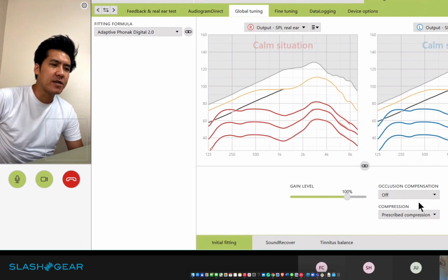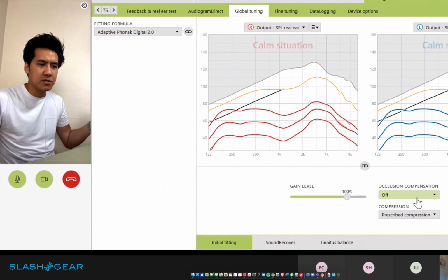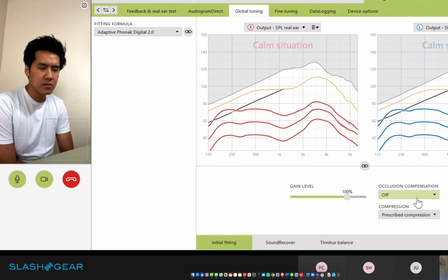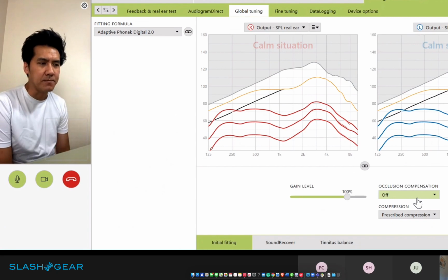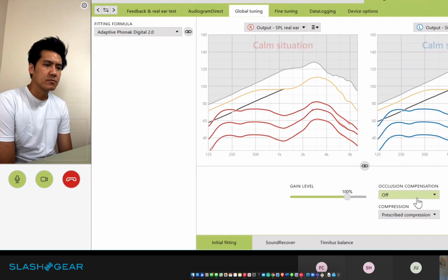I've heard that used for me before, where it allows more openness. Is that right? Okay. Yes. So for this case, I would not apply it because of the earpiece you have. Okay. Oh, because there are already two vents that are designed into the earpieces. Exactly. And you mentioned before that you had more of a custom earpiece. Do you remember if you had the Virtual before?